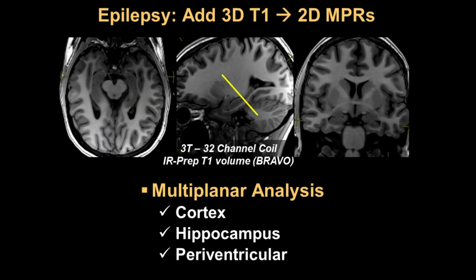Now, as we go through and look at epilepsy, we'll find that we should be spending more time and resources on these protocols for these patients. It wouldn't be appropriate, I think, to just have a seizure protocol for everyone, because you'd probably be doing too much for the new seizure patient and not enough for the chronic refractory epilepsy patient. At least you can fine-tune it and spend your resources getting extra imaging for those refractory epilepsy patients.